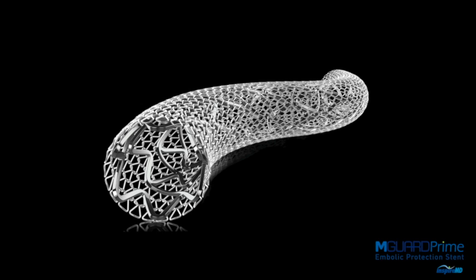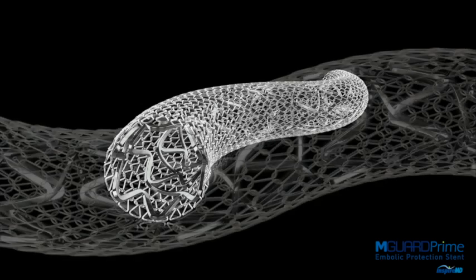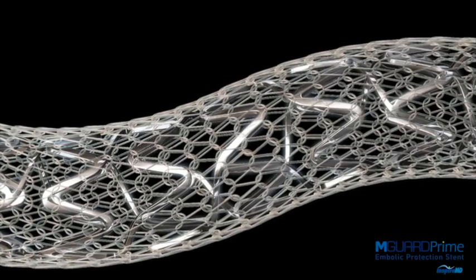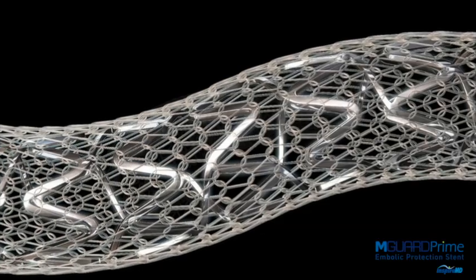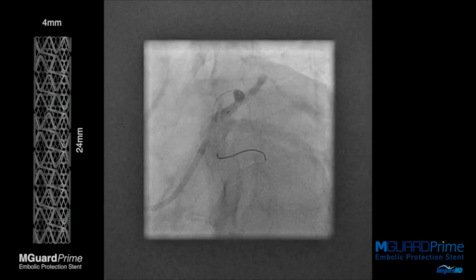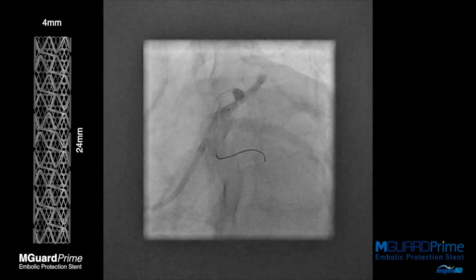The MGuard is a stent with a mesh on its surface designed to trap thrombus. The problem is it's not normally recommended to be inserted across a branch, but in this case I felt I had no option other than doing that. So I took an MGuard 4mm in diameter and 24mm in length and positioned it in the LAD.